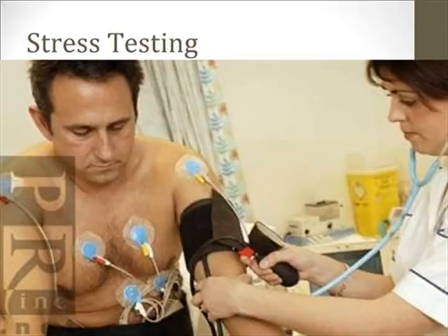The risk of doing the test is possibly suffering a myocardial infarction and death. It can actually detect irregular rhythms, peripheral artery disease, exercise-induced hypertension, as well as evaluate the effectiveness of medications and regimens.